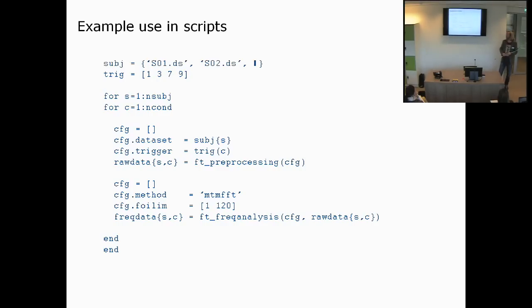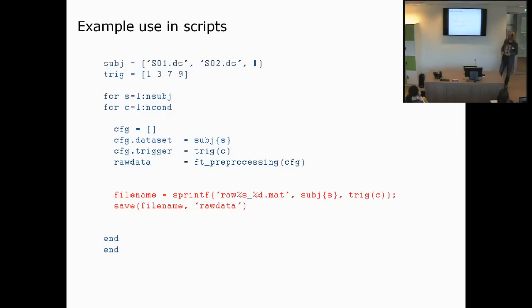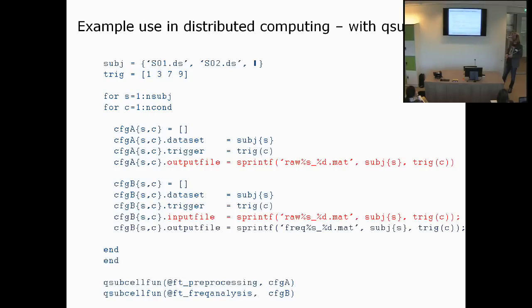And in the morning, you're probably going to find that it ran out of memory. Because what I'm doing here, I'm storing everything in local MATLAB variables. So actually what we do most often is that in such a script, we write the data to a file. So that means that the next morning you will find all these files on your disk. Of course, if you script your analysis like this, it also means that you can very easily use distributed computing.